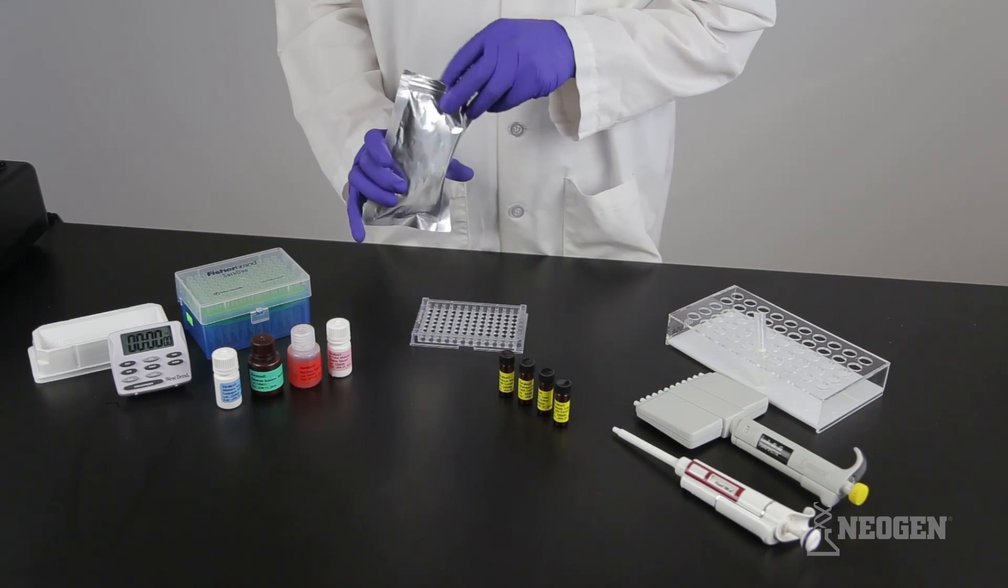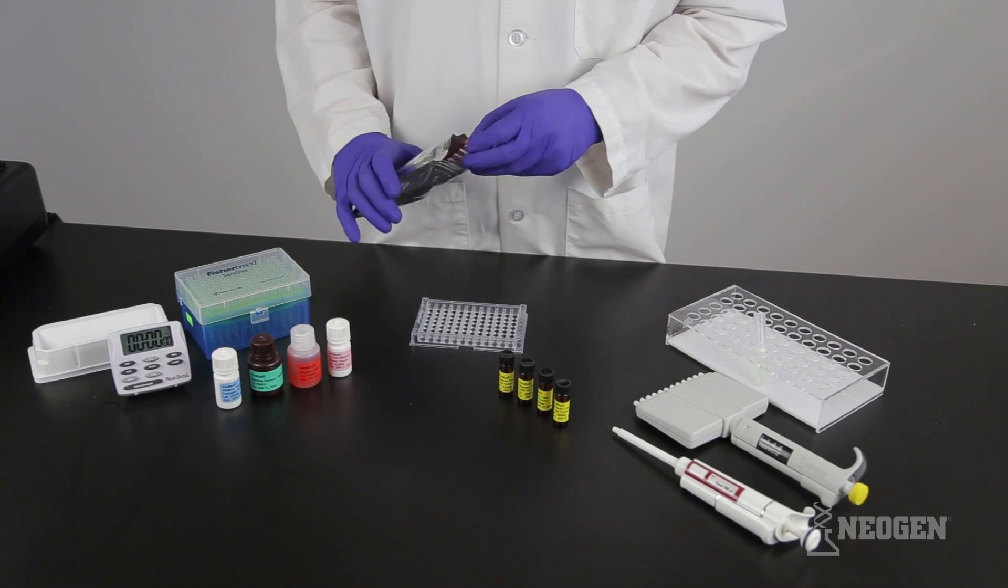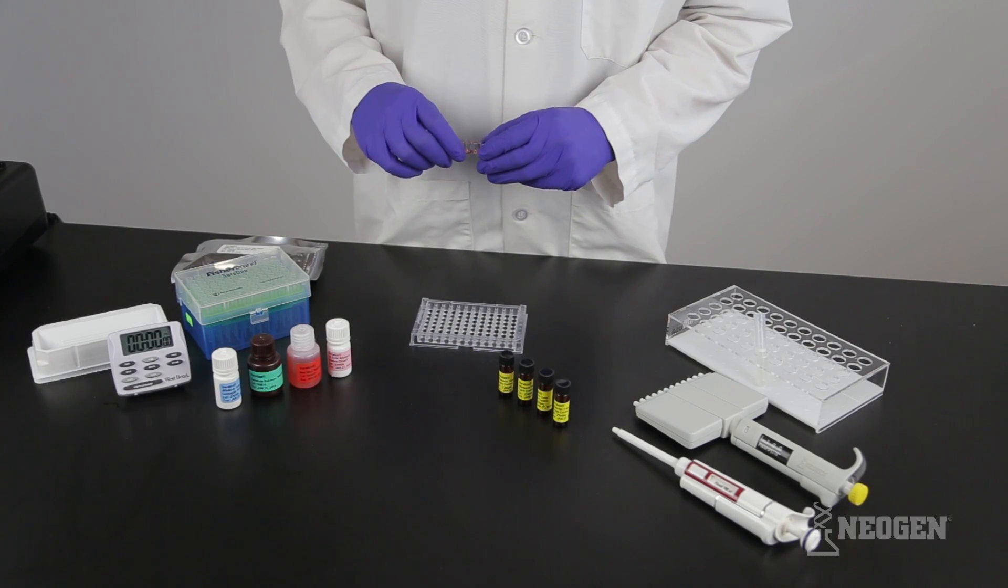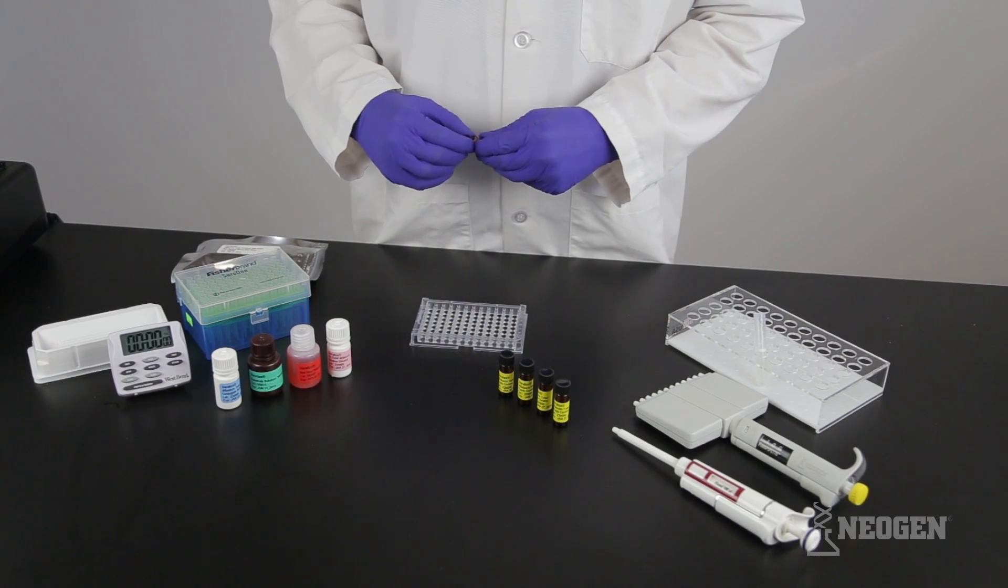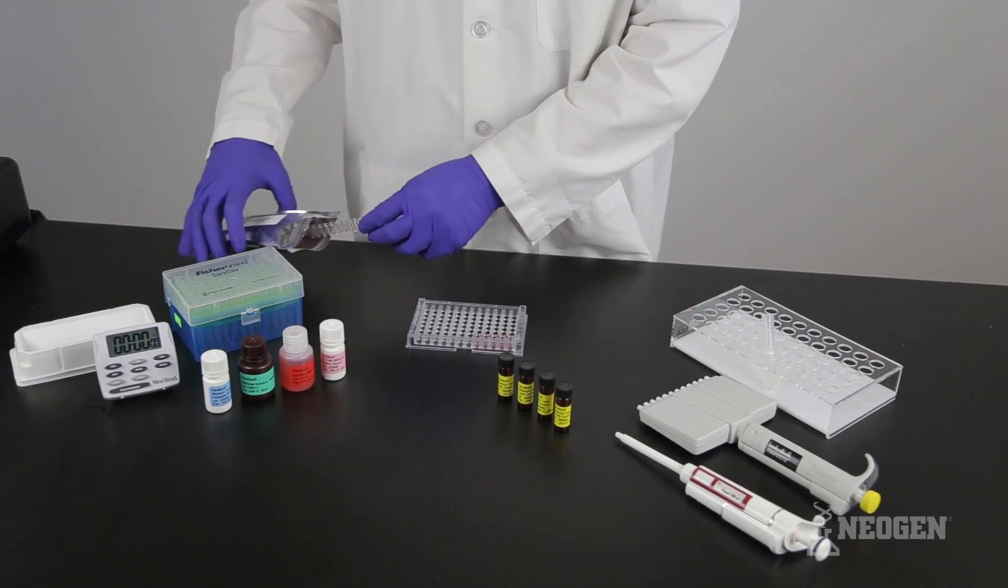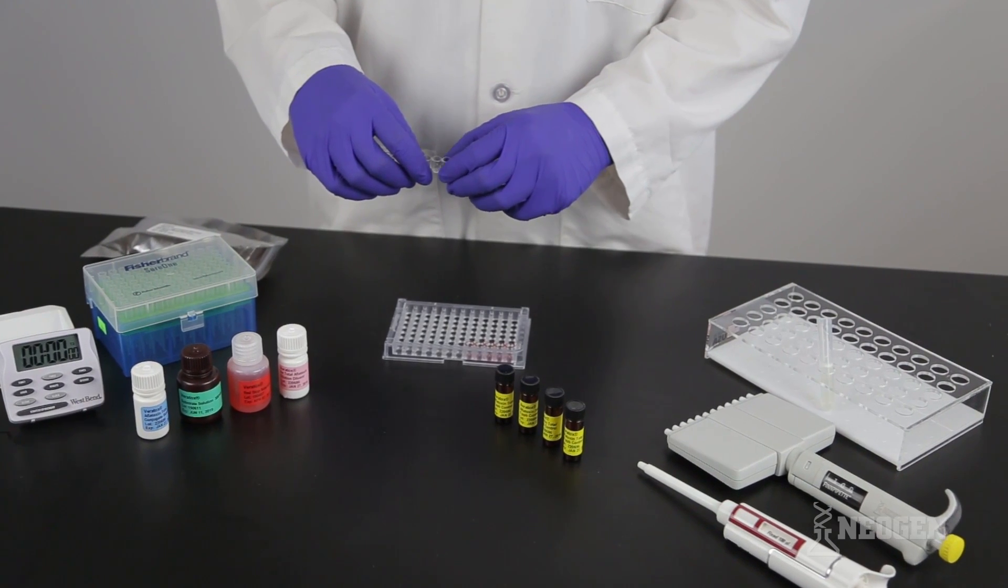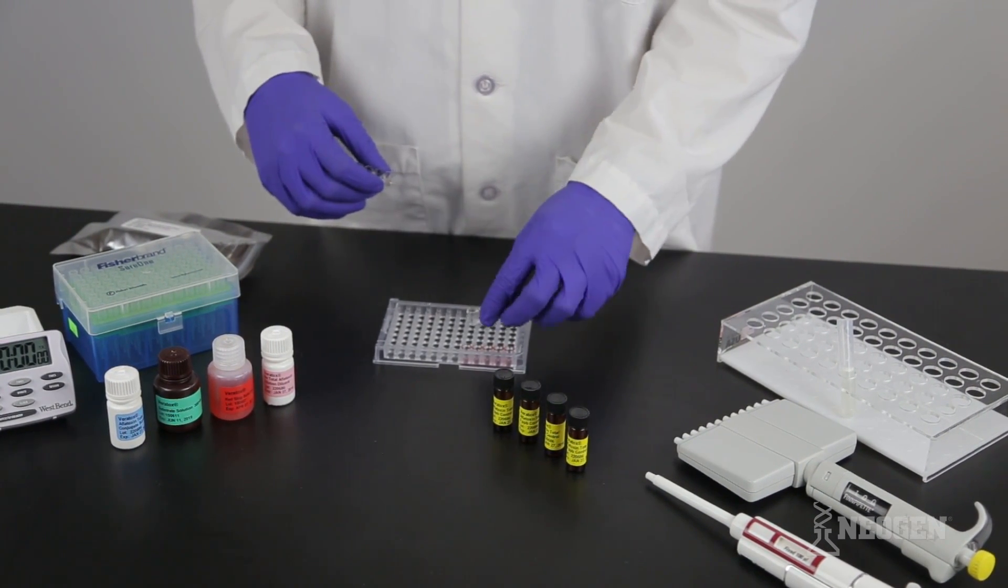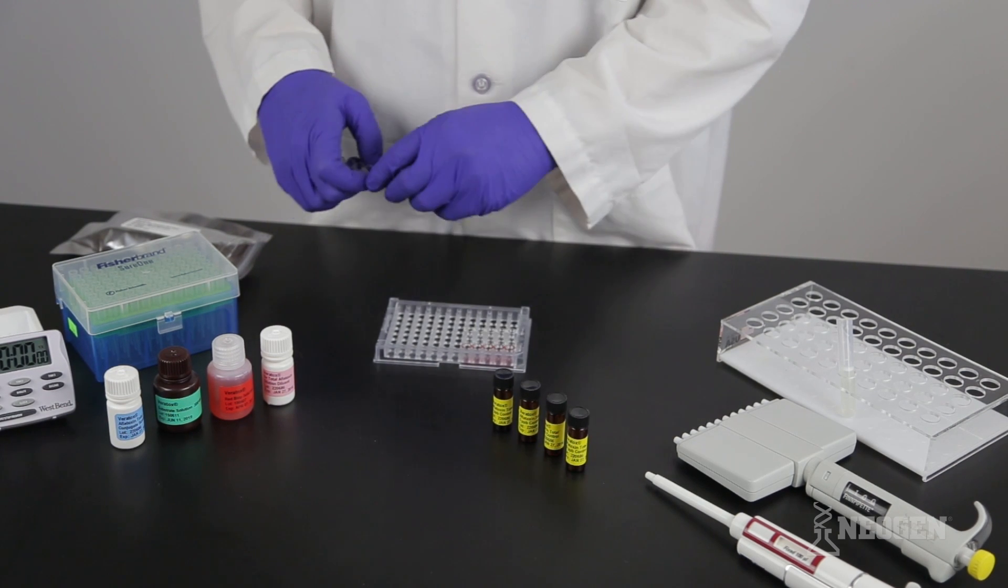To begin, make sure your kit is at room temperature. Remove one red marked mixing well for each sample to be tested, plus 4 red marked mixing wells for the controls. Place the microwells into the well holder. Remove an equal number of clear antibody coated wells, mark one end of the strip with a 1, and place the strip in a well holder with the marked end on the right.